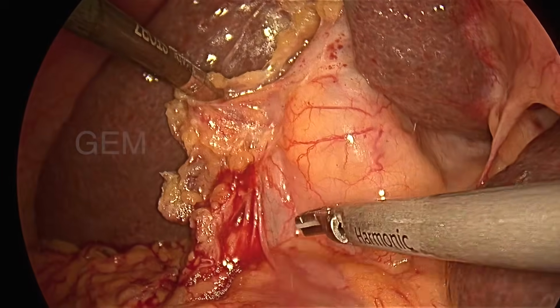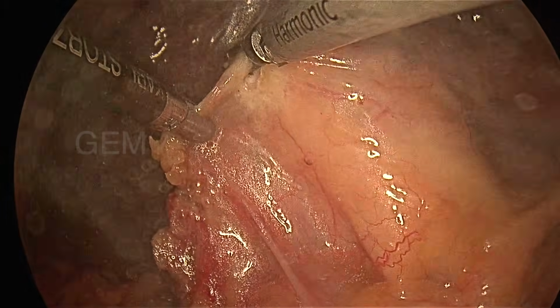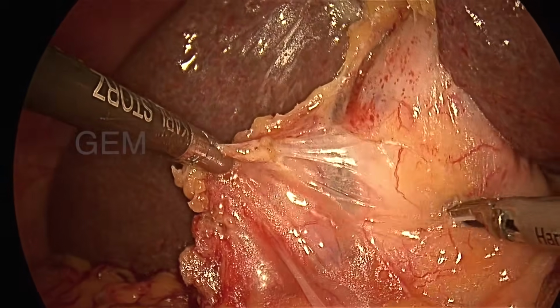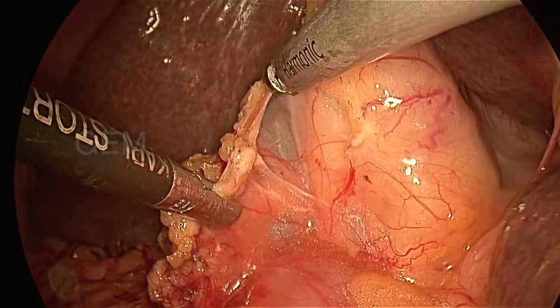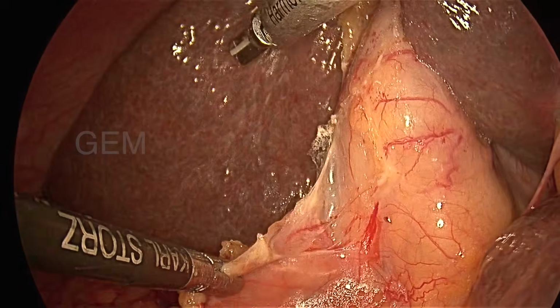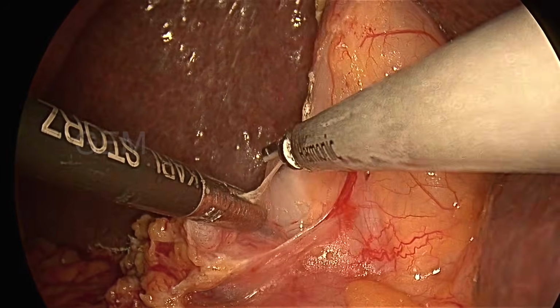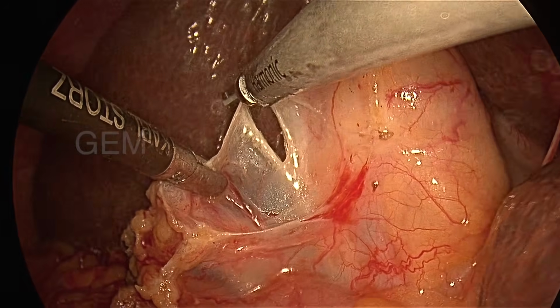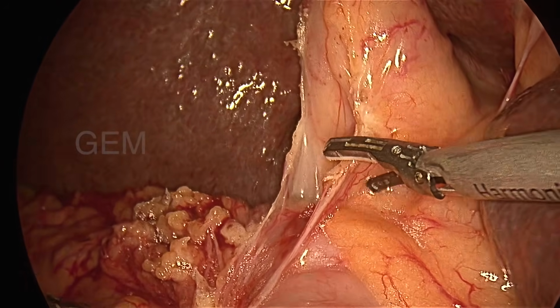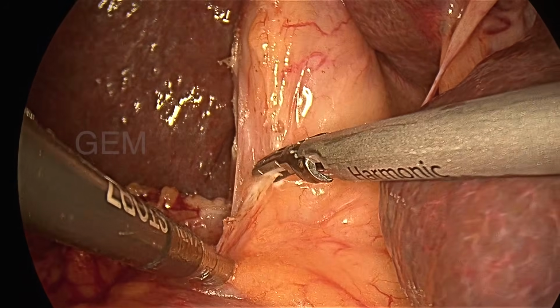So a little bit of gallbladder is there. It's not a much contracted gallbladder. It is a chronic cholecystitis. So I'm coming down. Once you see the wall of the gallbladder, you can go close to the wall and release all the omental adhesions, anterior, medial and lateral, all the area, and you can see the duodenum down. I come up to the duodenal level.